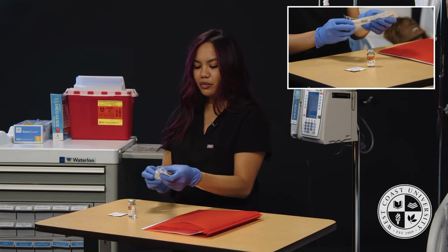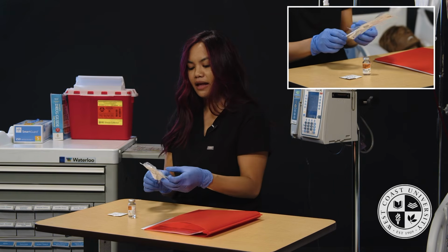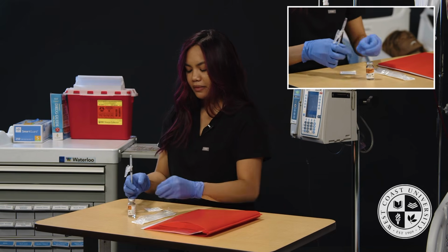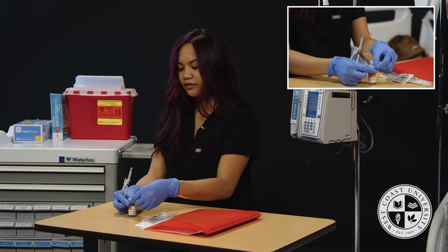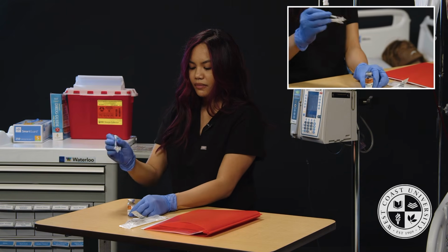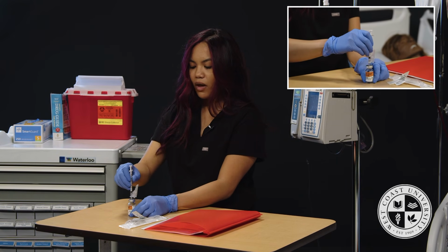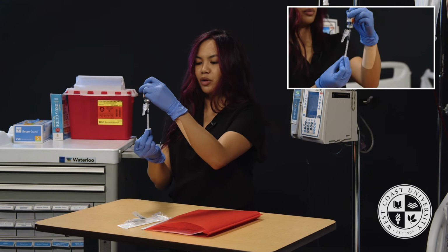So while there are other ways that your instructors may show you how to insert the needle into the vial, I'm going to show you the proper ATI way. And so you're going to go ahead and prepare your needle. You're going to scrub your vial for at least 20 seconds and allow it to air dry. You're going to go ahead and safely uncap, and you are going to poke the needle into the vial while the vial is on the table, and you're going to go ahead and draw up the appropriate dose.